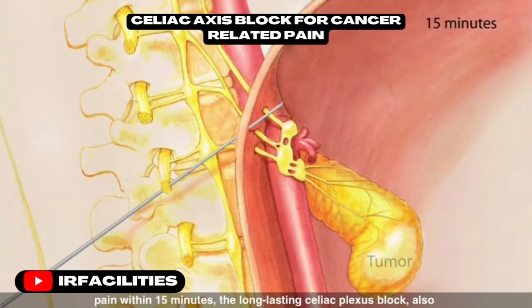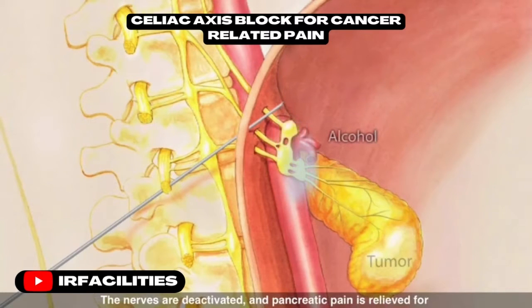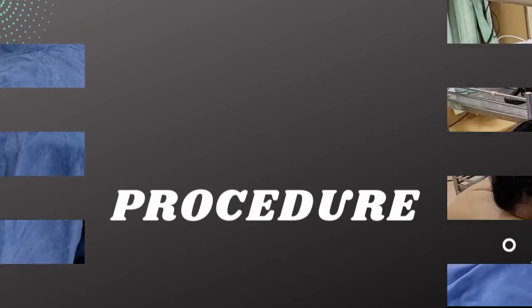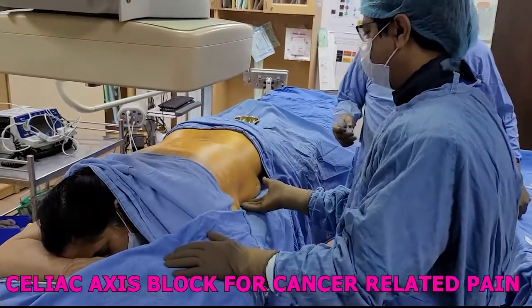With the needle in place, a temporary anesthetic is delivered. If the anesthetic relieves pain within 15 minutes, the long-lasting celiac plexus block — also known as neurolysis — is implemented by injecting strong alcohol. The nerves are deactivated and pancreatic pain is relieved for three to six months following the procedure.